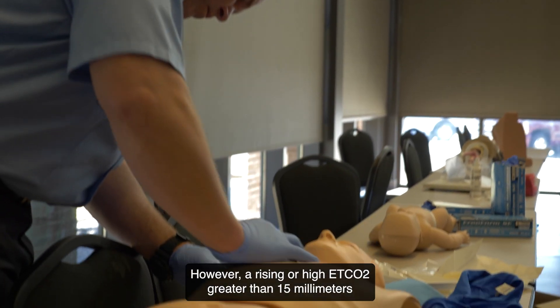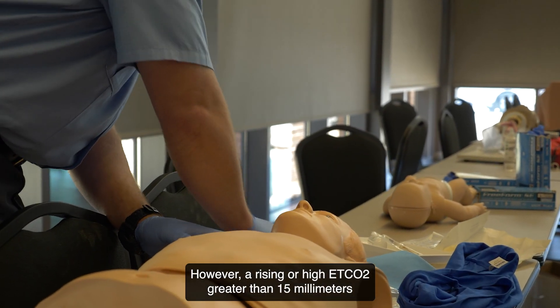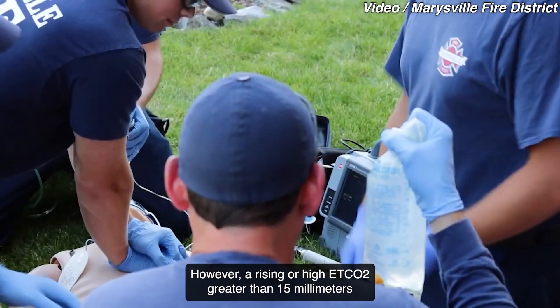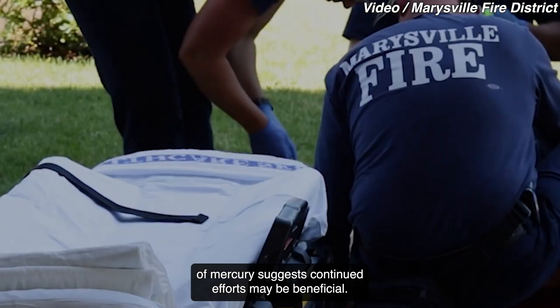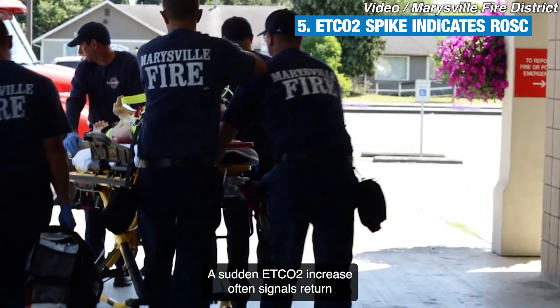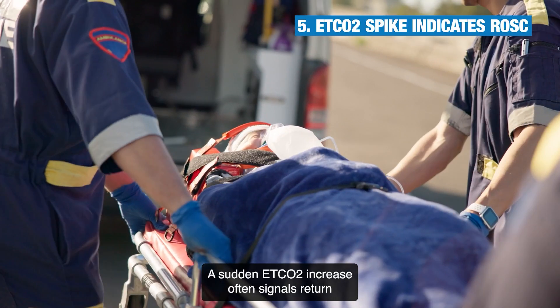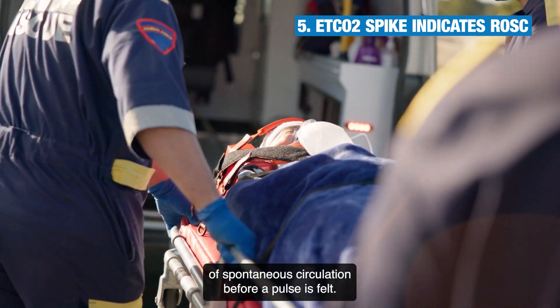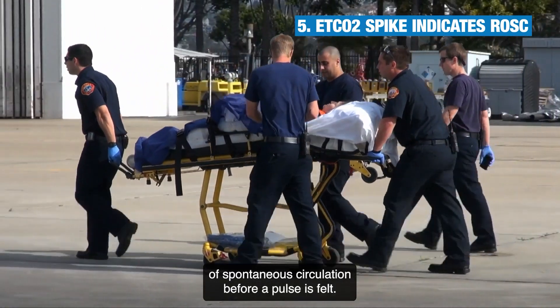However, a rising or high ETCO2 greater than 15 mmHg suggests continued efforts may be beneficial. A sudden ETCO2 increase often signals return of spontaneous circulation before a pulse is felt.